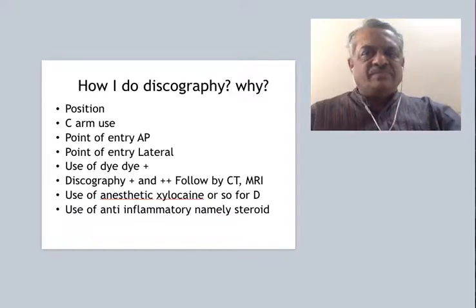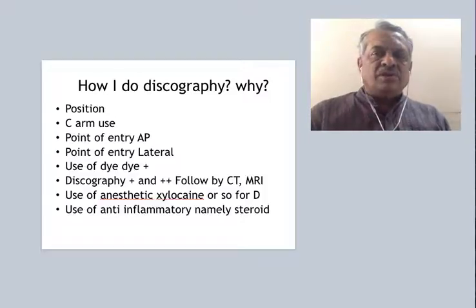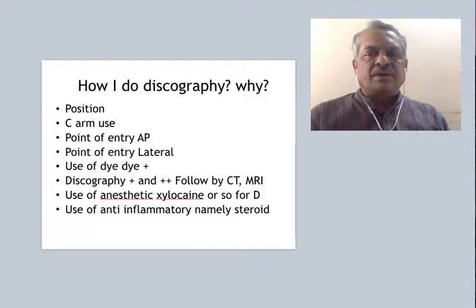Hello and welcome. Now this talk is about discography, and it would essentially tell you how I do discography and why I do discography. The first thing is the position of the patient is prone, and we normally stand on the symptomatic side of the patient. We use a C-arm for getting fluoroscopic images of the spine in AP and lateral.